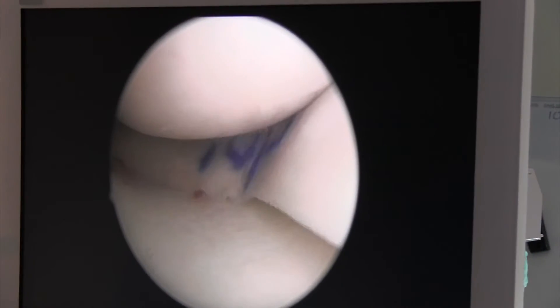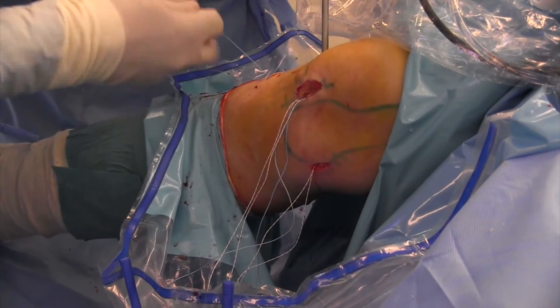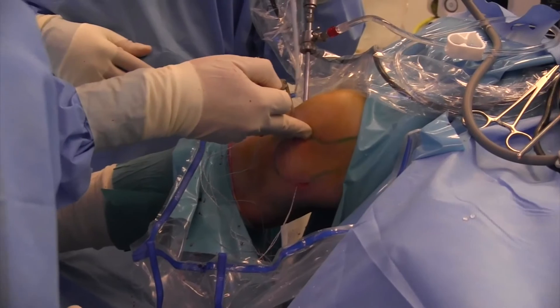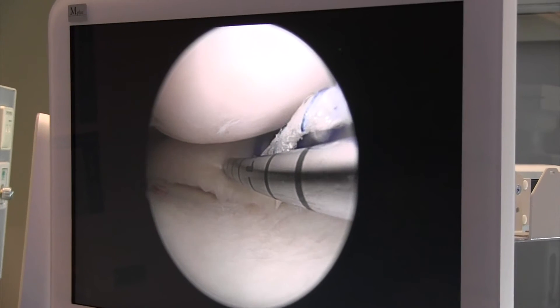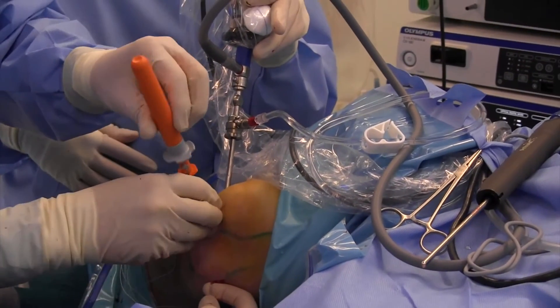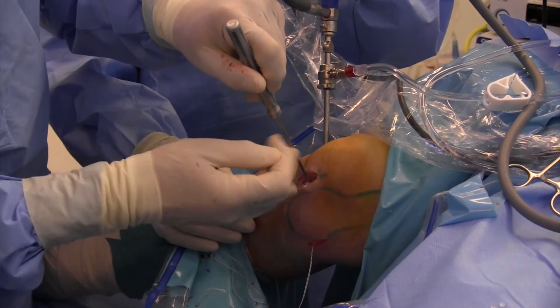As you can see here, the meniscus with the bone plug is in the socket. Now the suture is tied and knotted over a button. Then I put two or three all-inside sutures at the posterior horn, depending on the width of the meniscus. By pulling on the posteromedial suture, you get the capsule tied to the meniscus — and not the meniscus tied to the capsule — so that the meniscus stays in the anatomical position.